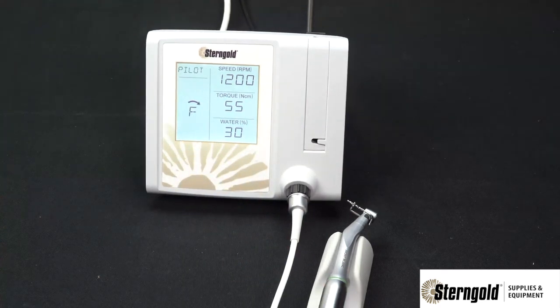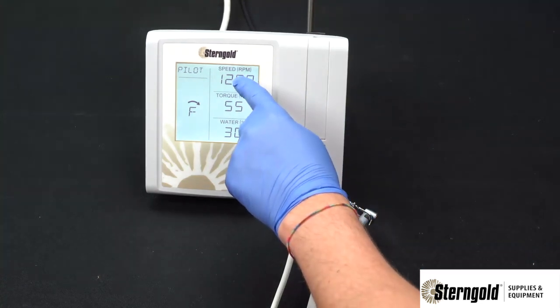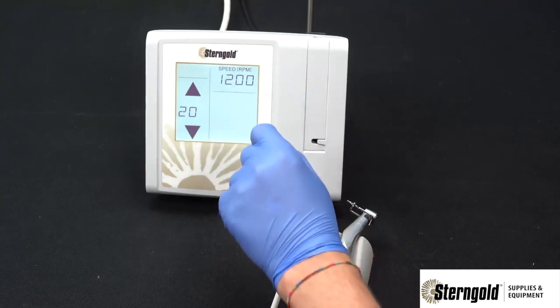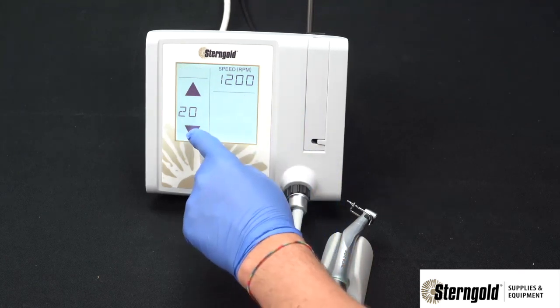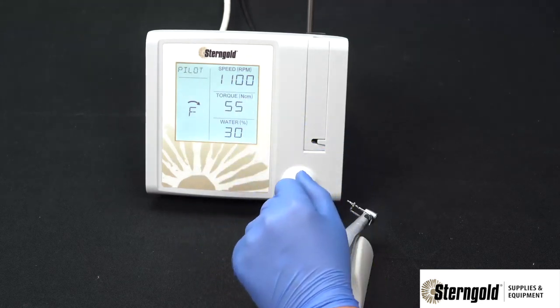The unit includes four factory presets, which are reprogrammable by the user in a very simple way. Simply select the parameter you wish to change and go into that parameter's adjustment screen. You'll notice that the preset begins to flash because the unit is expecting the user to make an adjustment. In this example, we will decrease the speed, then go back to the operating screen.